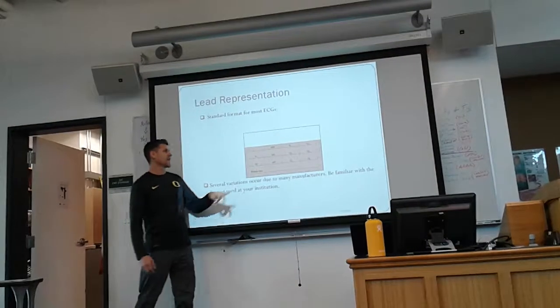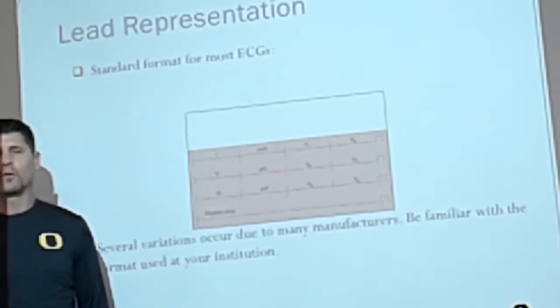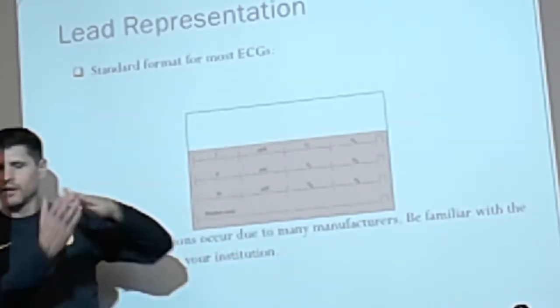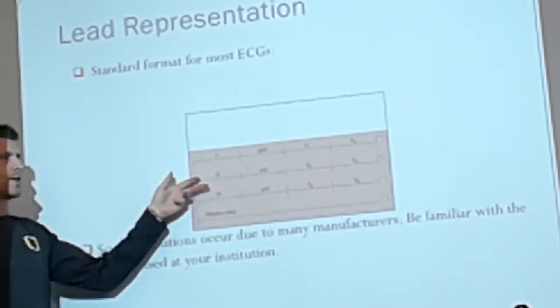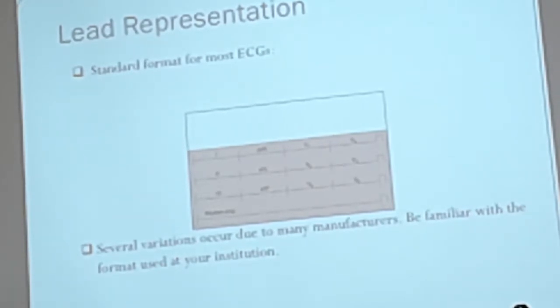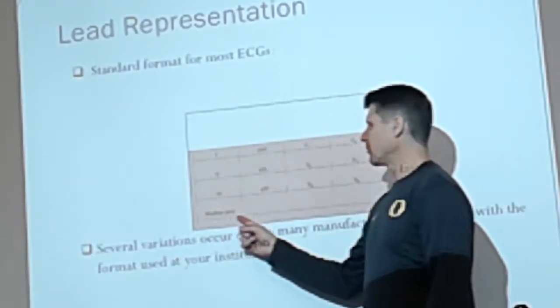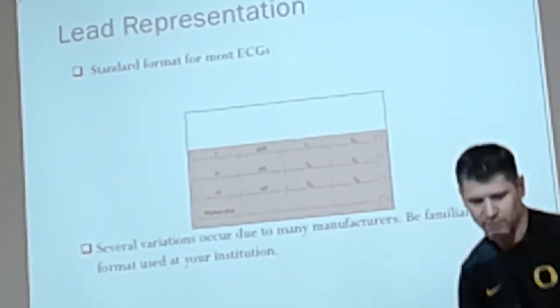All 12 leads will come out in this way unless they are physically changed for some reason. The hospital, depending on what floor you go to, will have some EKGs that have actually all 12 in one big long line. And they have it all together in that manner. In which case, it's almost always in the same order: 1, 2, 3, AVR, AVL, AVF, V1, V2, V3, V4, V5, V6. Just all 12 together. That's a possibility too. Pre-hospital monitors will always print out this way unless we force it to change in some manner. Good? Whether or not you have the bottom rhythm strip is just completely dependent on the manufacturer and the monitor that your agency chose to buy.